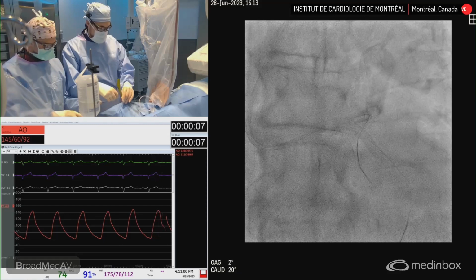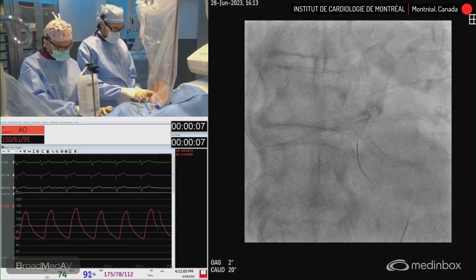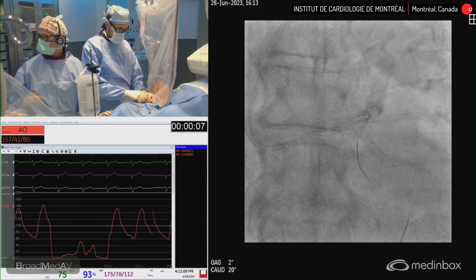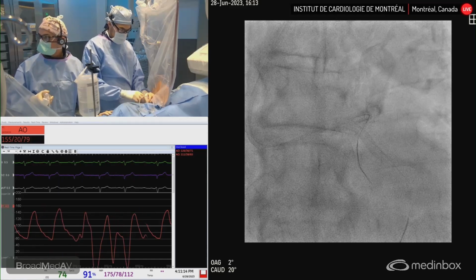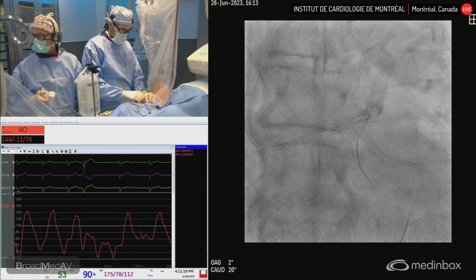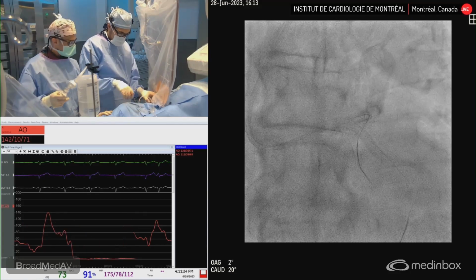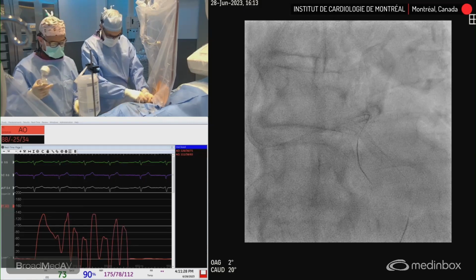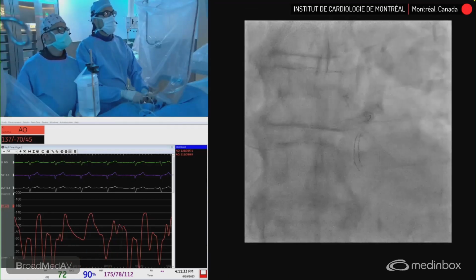Okay. I'll put it negative. Hopefully it's going to help. Such a big vessel, I think we're not gonna have big issues. Yeah, exactly. The patient has been very, very good. Last week he could not handle 5 minutes, and now almost an hour and 40 minutes of procedure, better than last week for sure. It goes in with difficulty. It's good, it's true. Well, IVUS is ready. Hopefully we get nice images on the IVUS, and we're happy.